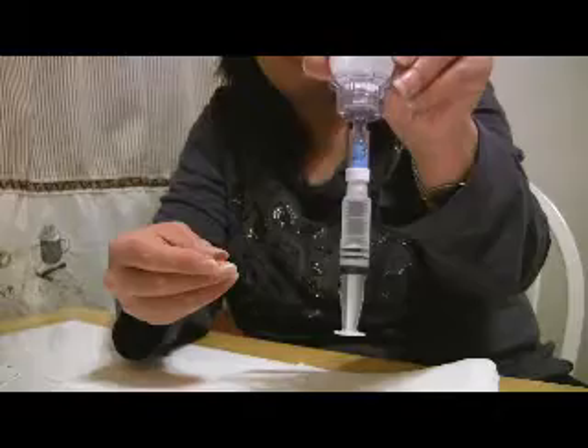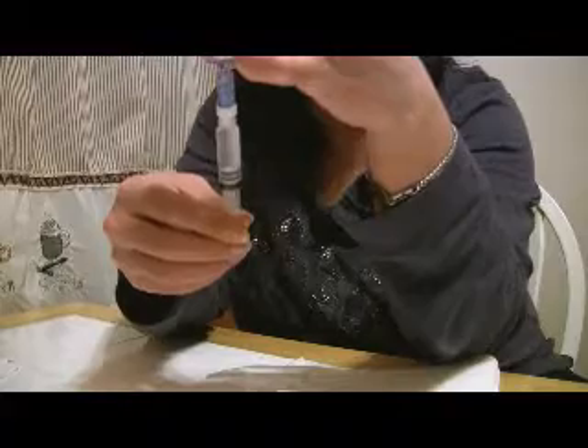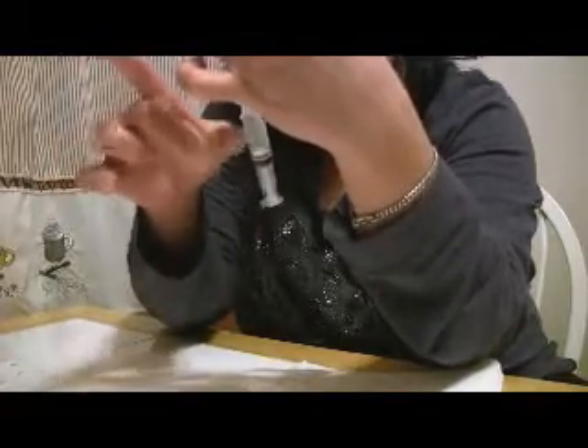As you can see, we have all sorts of bubbles in there. We have to get all the bubbles out — there's a whole bunch of bubbles in the front. What I'm going to do is actually flick with my finger, and then push the part with the air out, and then draw back again to make sure that I have enough medication. I just flick it a couple more times to make sure there's no air hiding anywhere.